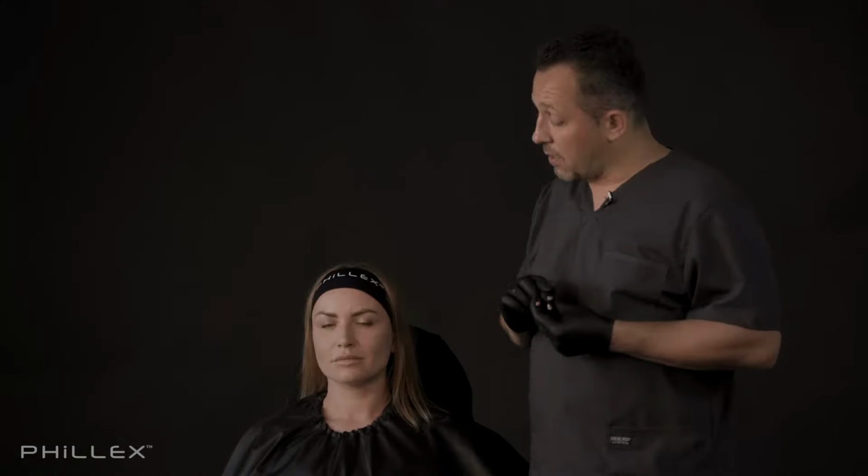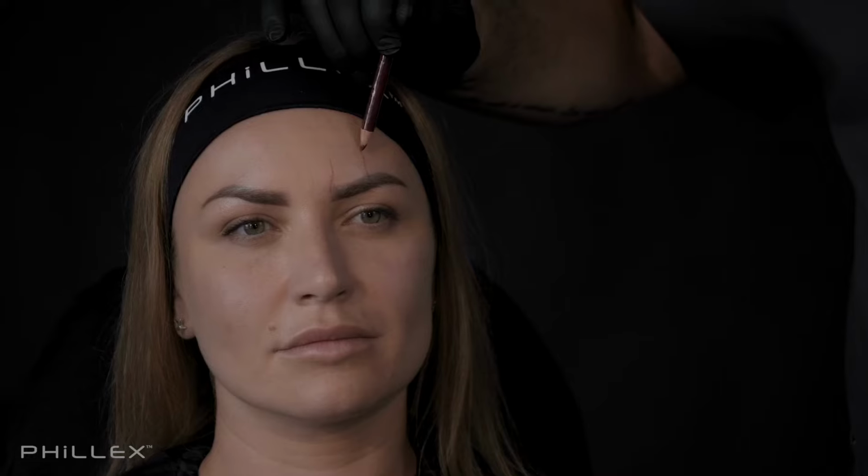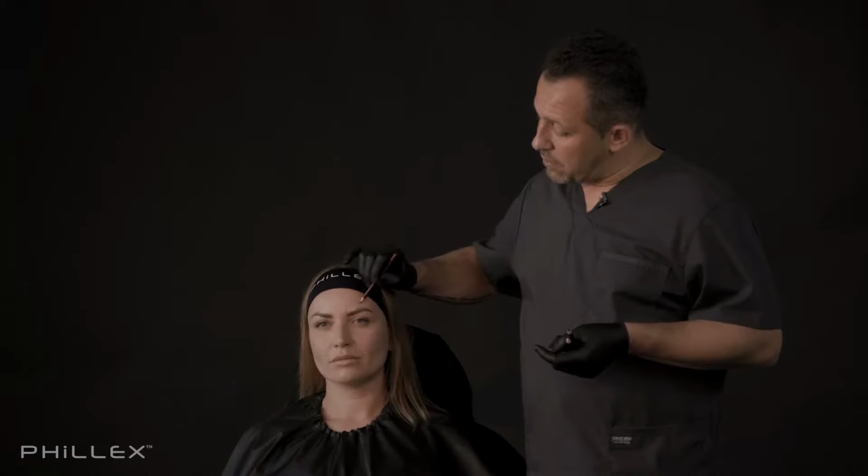Sometimes we have to inject the lateral portion of the forehead, and when we are injecting, we have to remember about arteria supraorbitalis and about the collateral that is connecting arteria supraorbitalis and arteria temporalis superficialis. Working in this area, we have to be very careful not to damage those vessels.